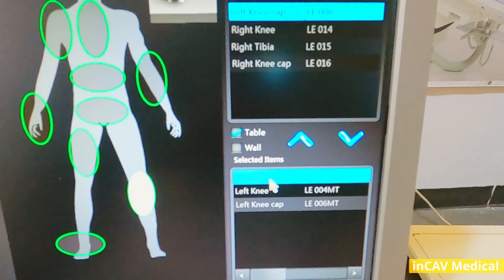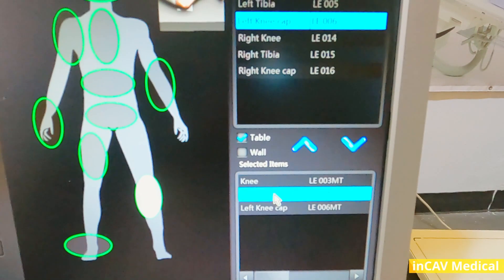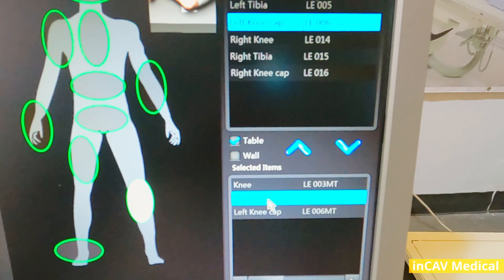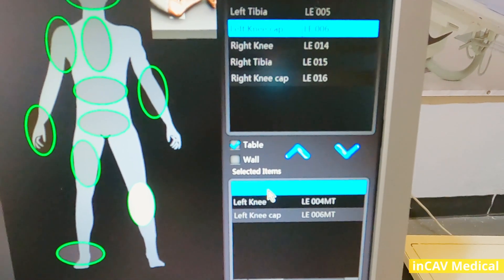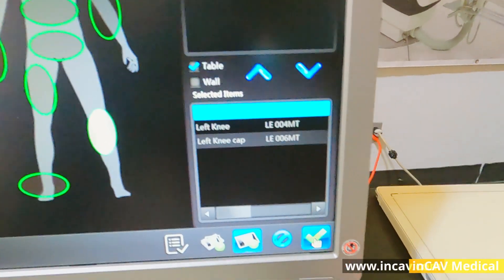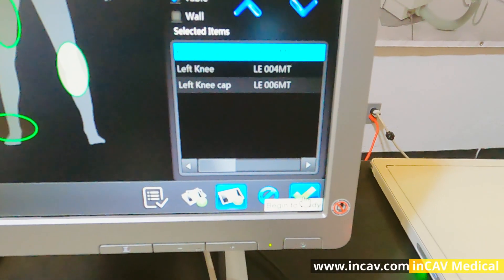When you are okay with the study list, just click on the green OK so you can begin the study.